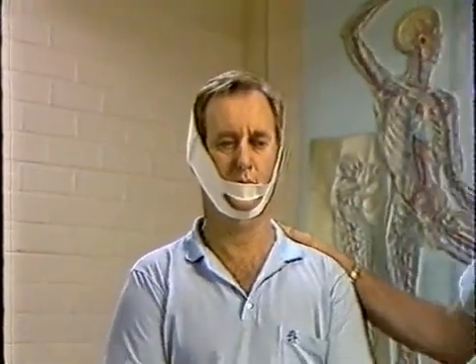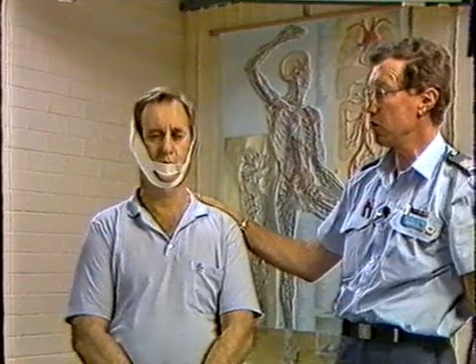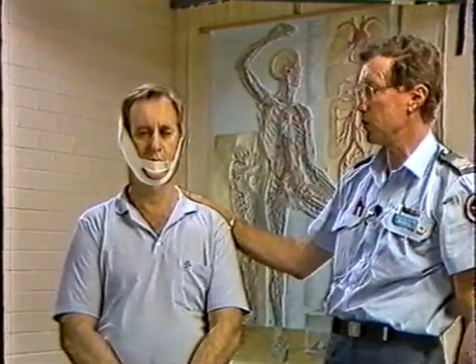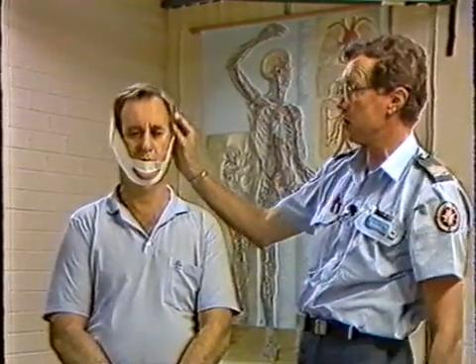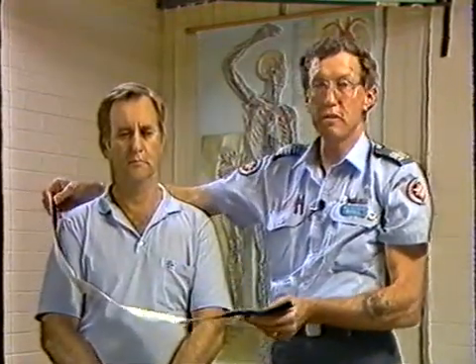As with any procedure where we're going to obstruct the airway for potential vomiting or any other similar blockage, we must be prepared to be able to clear the airway immediately if that problem surfaces. So in this instance, this is one of the advantages: if the patient was vomiting, or we needed to insert an airway, it's a simple matter of just undoing the Velcro. That's if you wish to do it.